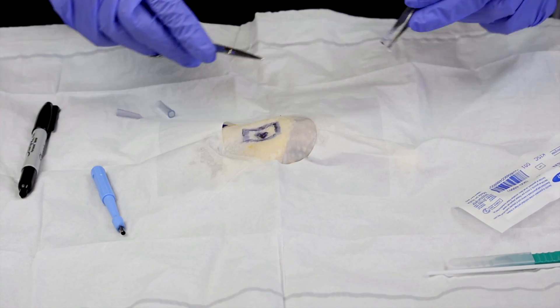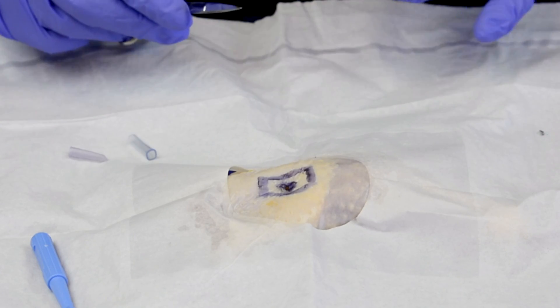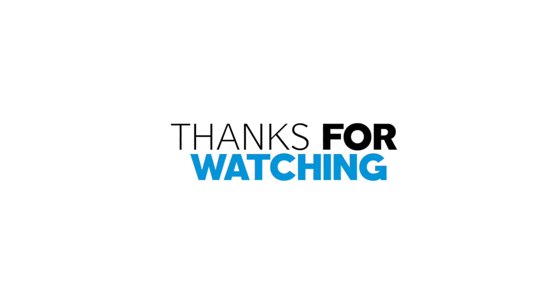Here's the actual biopsy that we brought out, and that is what we would send to the lab. Thank you.